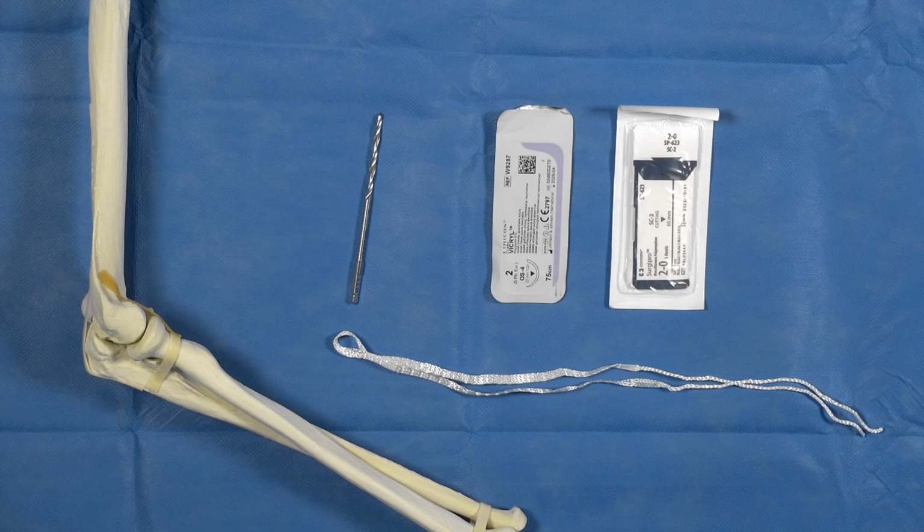It's important to have the option for a synthetic graft as well when considering a reconstruction for both medial and lateral ligaments. In most cases that's not necessary, but when you have a chronic dislocation or a chronic recurrent simple dislocation of the elbow, then it may be necessary to reconstruct both medial and lateral ligaments, and the use of a synthetic graft in that situation is extremely helpful. It avoids taking multiple autografts from the patient.